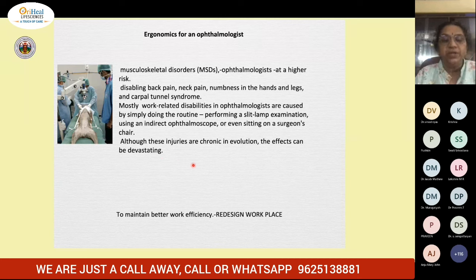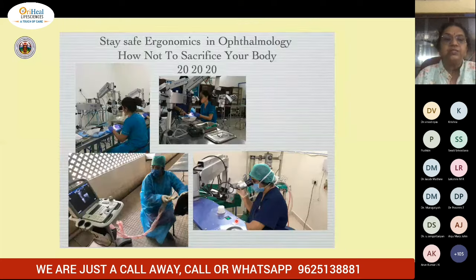What you have to do is maintain better work efficiency and redesign your workspace. That is very important. That is why I always say stay safe, not in pandemic season alone. You have to stay safe in ophthalmology also. How not to sacrifice your body. So the 20-20-20 principle is there. We ask the students to sit straight and then do all examinations. Here I am sitting comfortably on the floor and trying to do a B scan. It is not by just bending this side, that side and so on. You have to necessarily occupy a good position and then do the different tests.